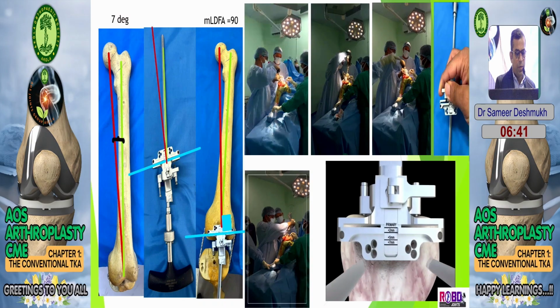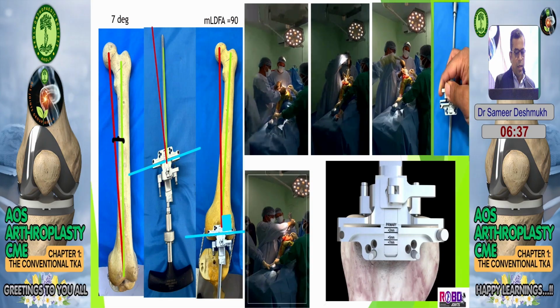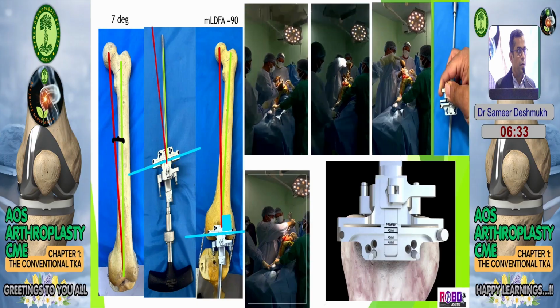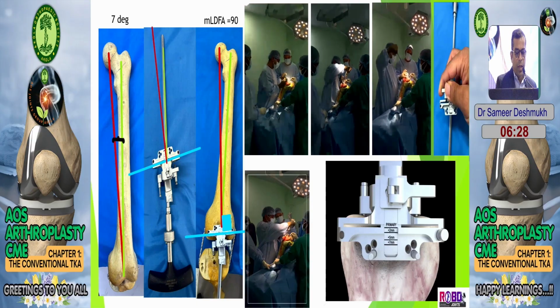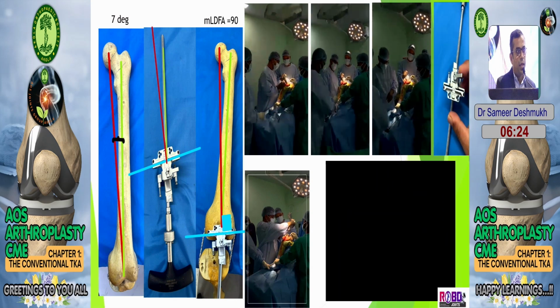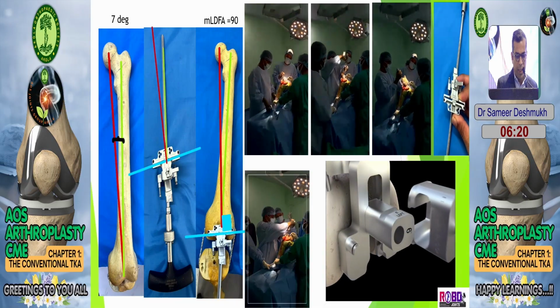So this is how we put the jig inside for the femoral entry. We attach the pins usually over the 0, 0, because later if I want to increase the resection, I can change it. There are also some settings on that jig so that I can take more resection if I require, in cases of FFDs.